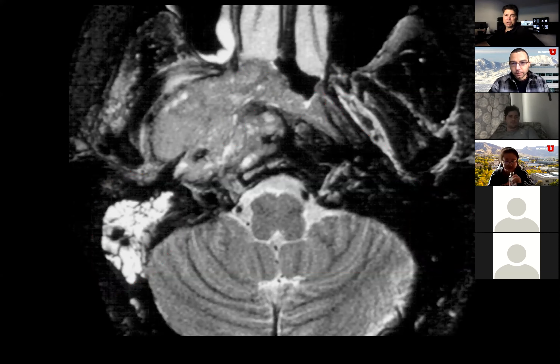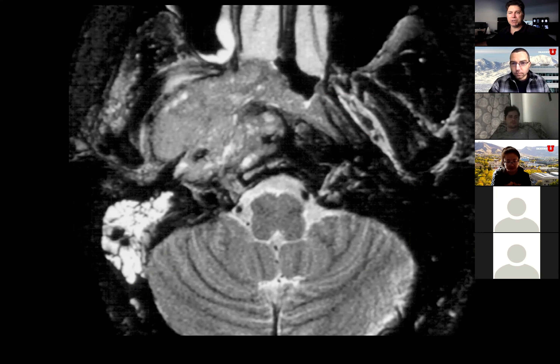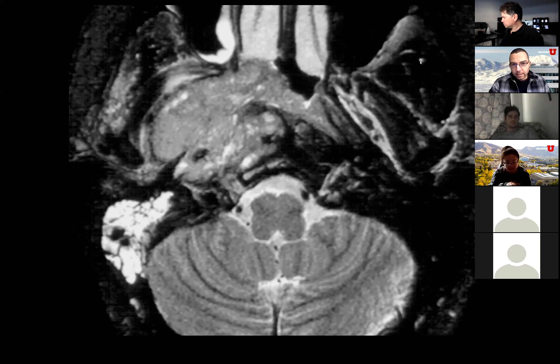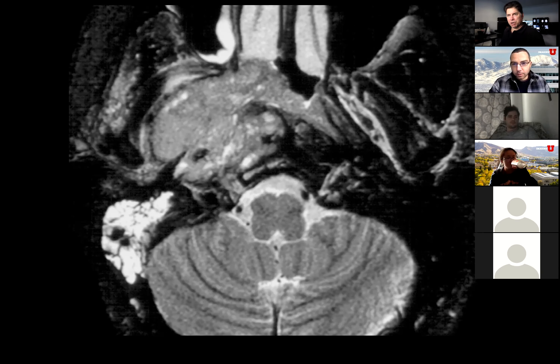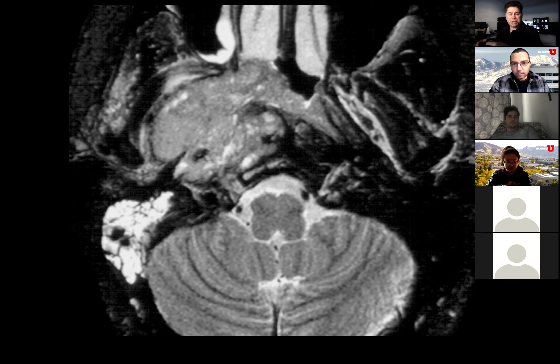This is a nasopharyngeal carcinoma. But what's in your differential? Nasopharyngeal carcinoma and squamous cell carcinoma are the same thing — we give nasopharyngeal carcinomas a different name because we treat them differently.